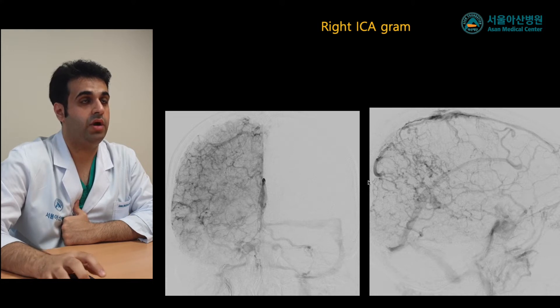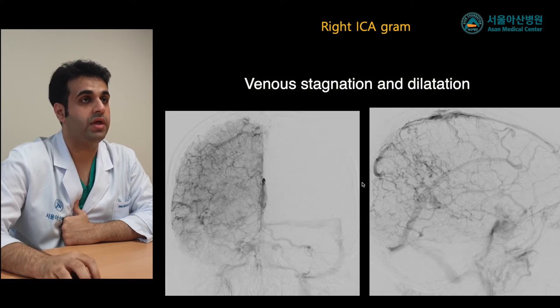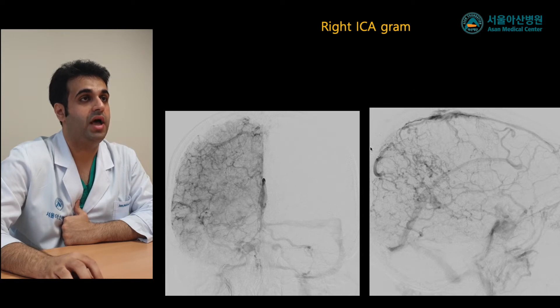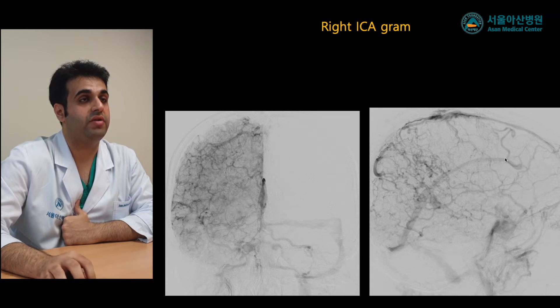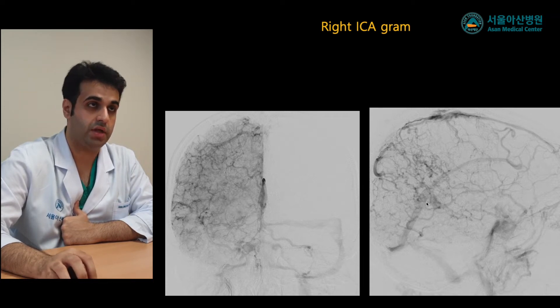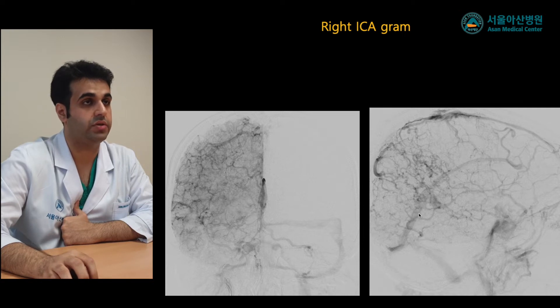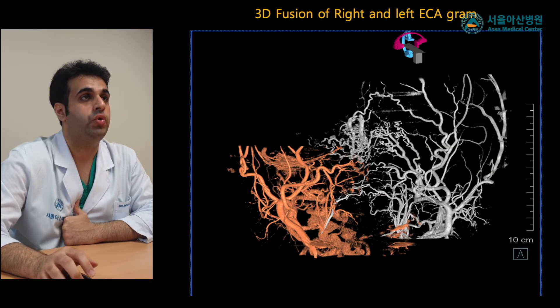The right ICA angiogram was performed and demonstrated venous congestion along the temporal and occipital region, interruption of the posterior superior sagittal sinus, and prominence of the inferior sagittal sinus as a compensatory mechanism.